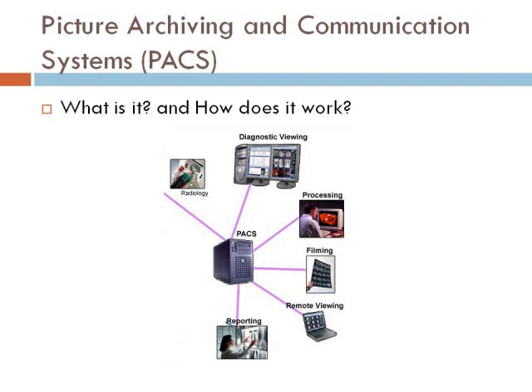PACS was made because it replaces the traditional way of storing hard copy images, such as from X-rays, on film. No longer do we have to store things and print them out on film. Instead, it's available through a network, and it can be transmitted digitally, kind of like the internet, and sent to different areas within the hospital, or whoever is on the PACS system will be able to have access to those images instantly.